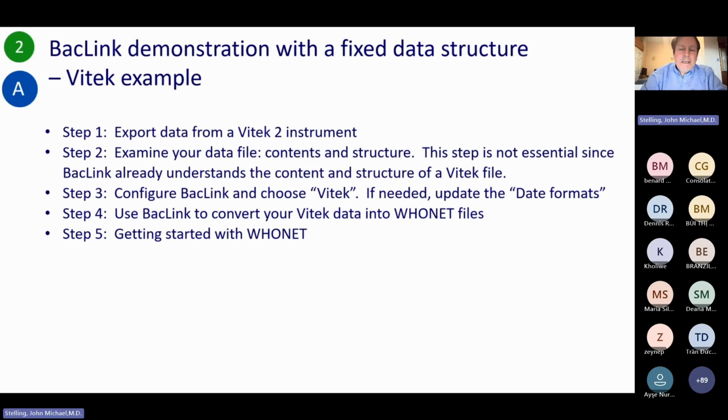I said that all Vitek exports are the same, except for small details like the date format. Here in the United States, we use month, day, year. Most of the world uses day, month, year. Sometimes people use the hyphen, dash. Other times they use the slash. That's not a function of the Vitek. That's a function of the local computer.